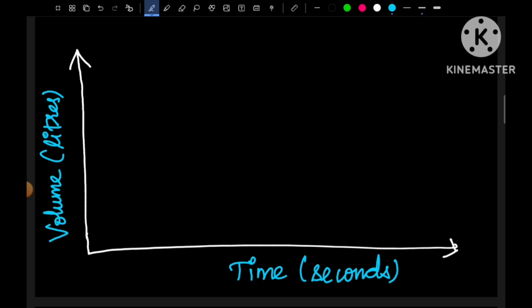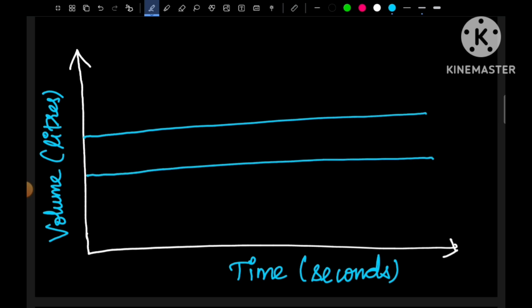Now we are going to draw this. See guys, first of all I would ask you to put two horizontal lines at the center. I'll draw it in blue itself, it will be easy. These lines are the reference points to draw this diagram. Might be in your university exams or wherever you want to draw this, you can easily draw it by putting a reference line.